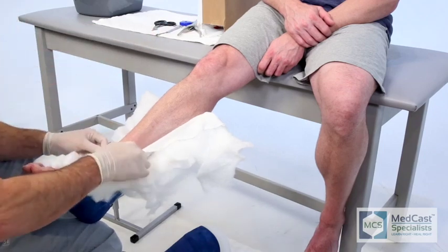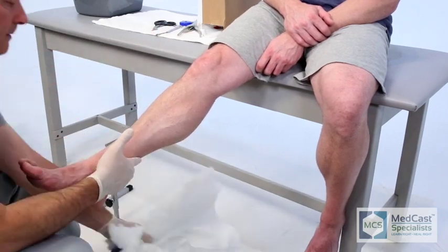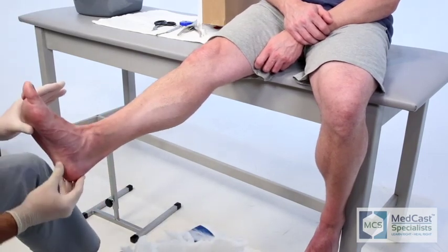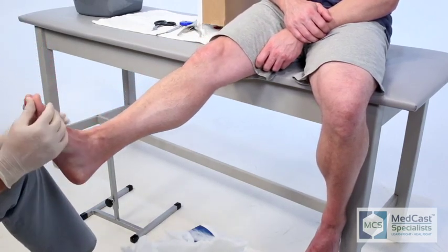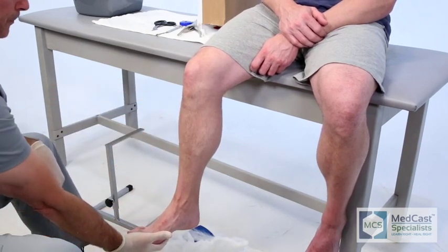I like to examine the anterior crest of the tibia just to make sure that there was adequate padding and there are no abrasions. It's also good practice as you're cutting up the tibia to have it just off to one side or the other so you're not dragging the saw right across the shin where there's no padding.